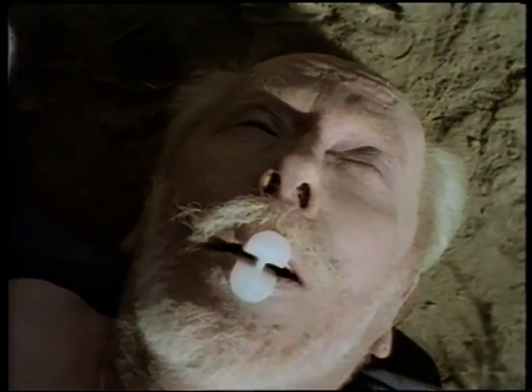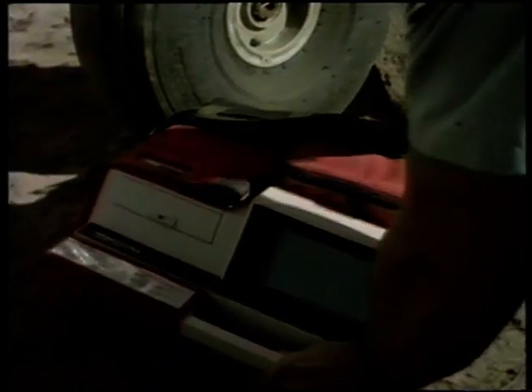Remember, you should only defibrillate a patient that is unconscious, has no pulse, and is not breathing. It is essential that you assess the patient using basic cardiac life support procedures before you use the LIFEPAK 300. The first step is to place the device beside the patient. Next, remove all clothing from the patient's chest. The other rescuer continues performing CPR.